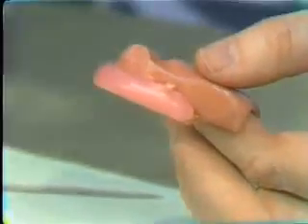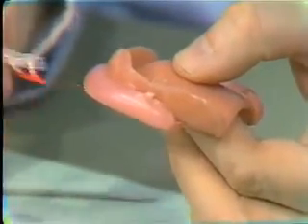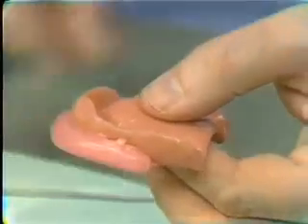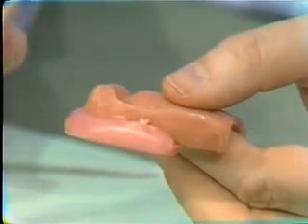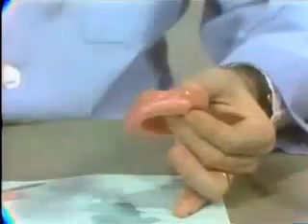And one of the most important areas, and we'll talk about this a bit later, is the relationship of the anterior part of the wax rim to the anterior part of the base plate. When people start out working with complete dentures, it's a common thought, and a logical one, I guess, that the teeth came out of the middle of the maxillary ridge. Well, they did not. They were labial to the maxillary ridge. And we should show this at this time in the wax rim.